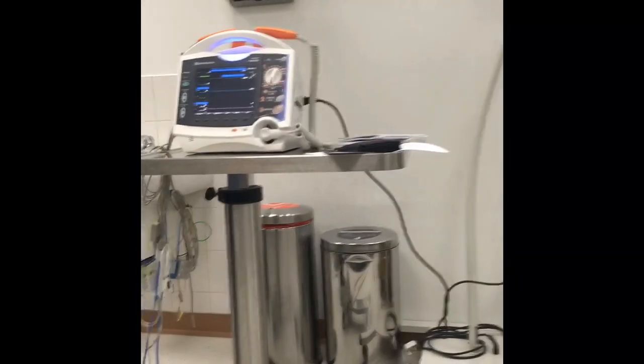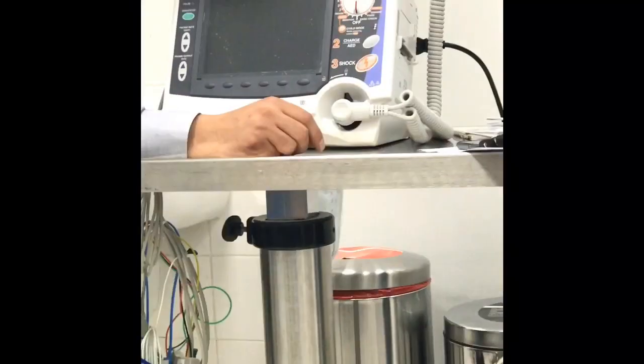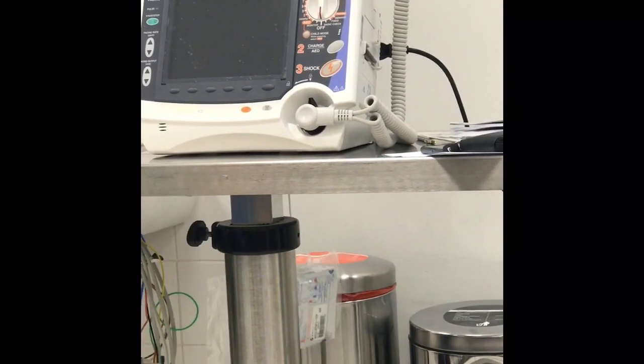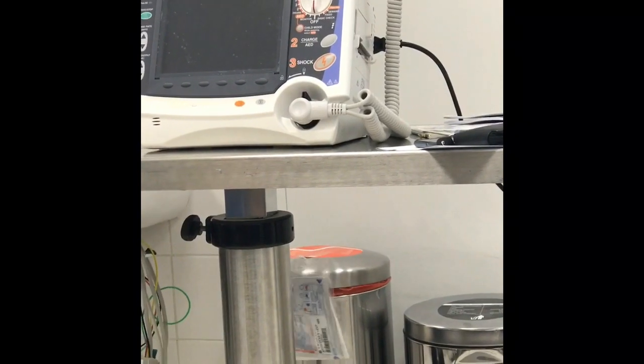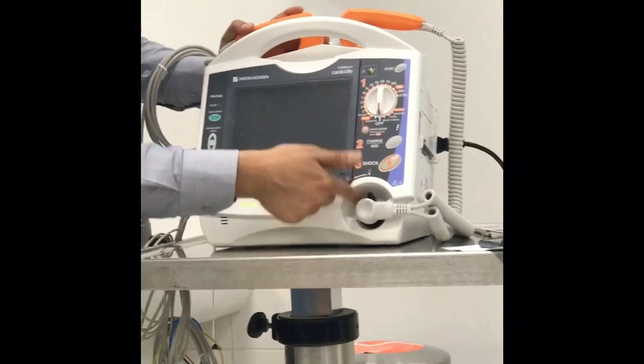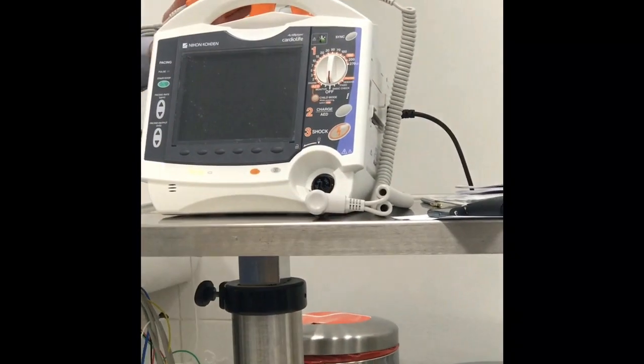We have a bag that will carry all accessories together. So in an emergency we will have only one bag. All will be in the back inside. So, lock and lock. Okay, connect the cable here. Keep this one in center. Okay, and push.